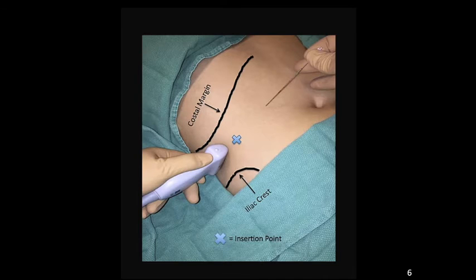To identify the anatomic landmarks for the TAP block, place the probe in the transverse orientation on the abdomen, midway between the lower costal margin and the iliac crest. The probe should be lateral to the rectus muscles, roughly at the level of the mid-axillary line. You can make small adjustments to the angle of the probe to make the abdominal wall muscle layers distinct.